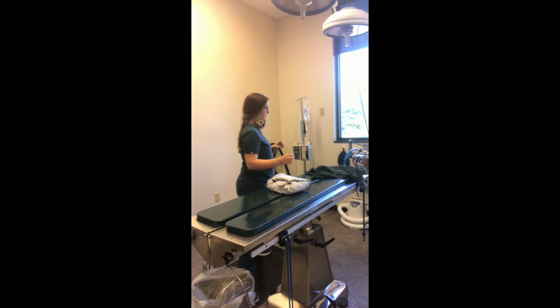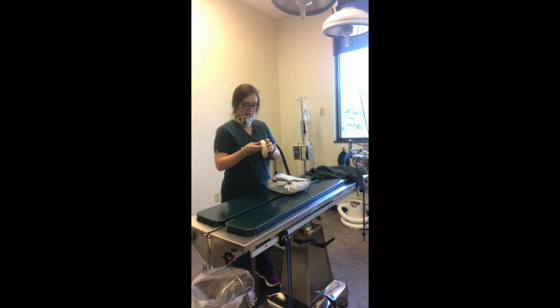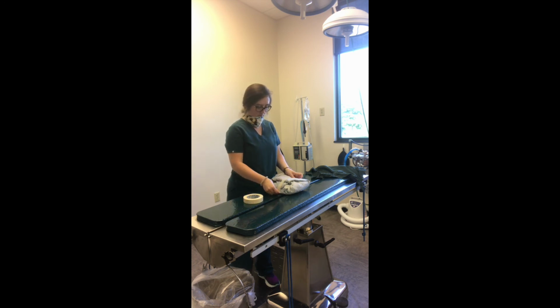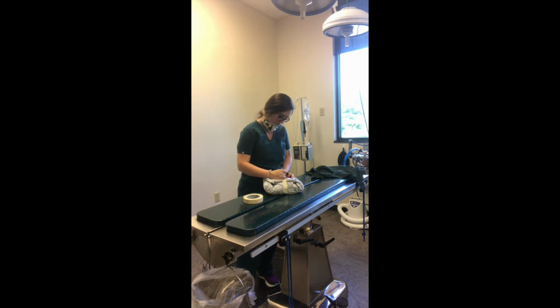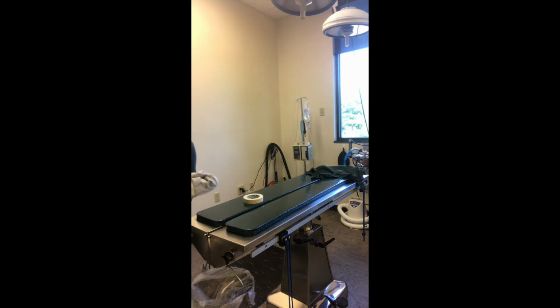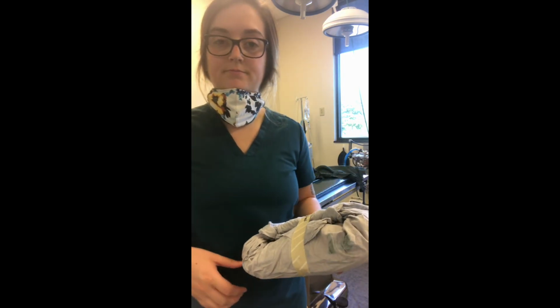At this point, you can put your tape on and label it with the size of the gown, your initials, and the date. Now this gown is ready for autoclaving.